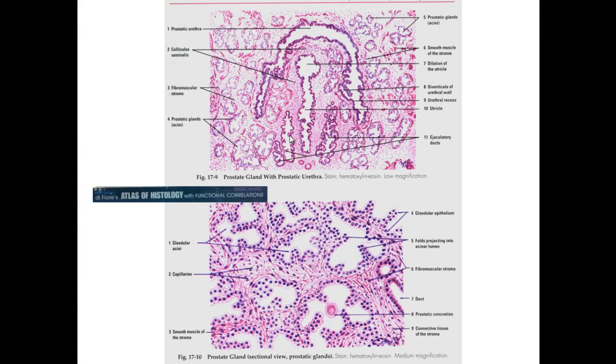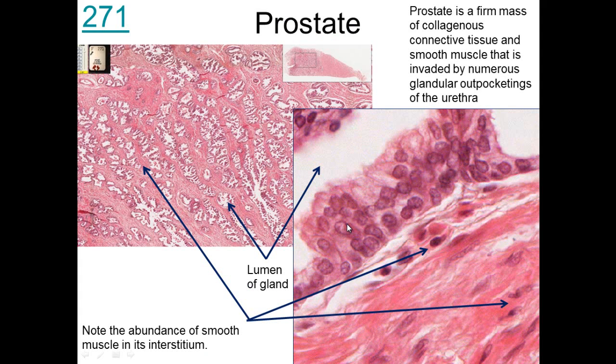their fluid, seminal fluid. And so in the prostate itself, we have the prostate here. You've got the urethra through there, and the ejaculatory ducts, where the sperm would be coming through from the ductus deferens that we can see. Here in the prostate, we can see the secretory cells, and a characteristic of the prostate is that there are smooth muscle cells in the connective tissue. So the heavier pink that we're seeing is actually smooth muscle cells.